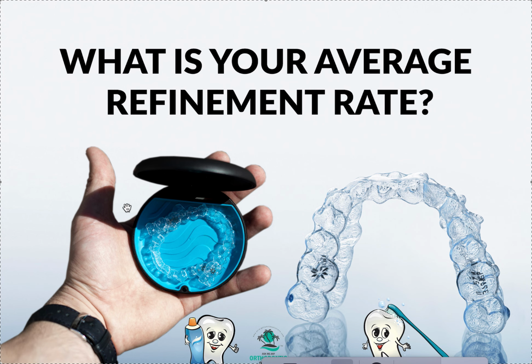Obviously, if there's any red flags, if things aren't fitting, we're going to tell the patient to either go back and try on the other aligners, or we're just going to have them bring all their old aligners in. Remember to make sure they save all their old aligners, and we're going to find out where they are. If it's way off, we're going to do a refinement. But most of the time, if you do these virtual check-ins, we can block. We won't have to do a refinement because we're going to tell them, hey, look, that's not fitting. We're going to catch the problem before it snowballs and gets really, really bad. Go back to the right aligner. Maybe now they're going to be in 2 upper and 3 lower, instead of 4 upper and lower, and have them catch up because we're not all perfect. And sometimes we have a bad week, right?